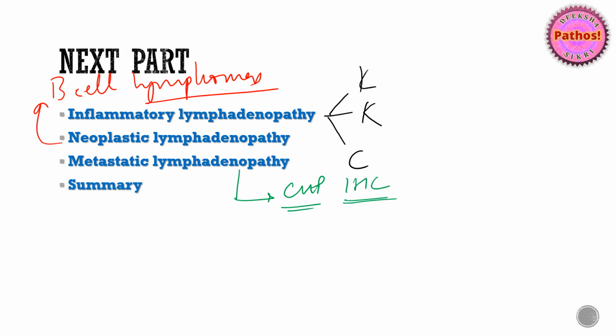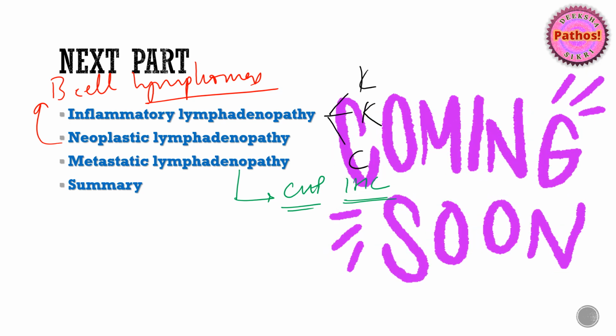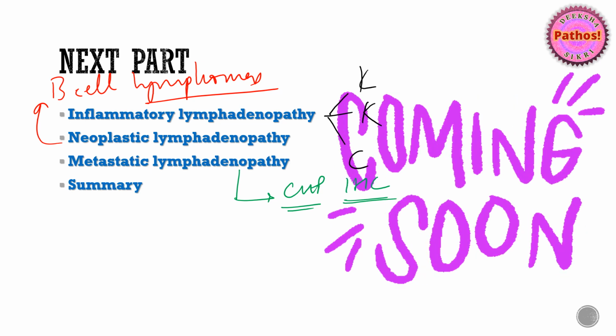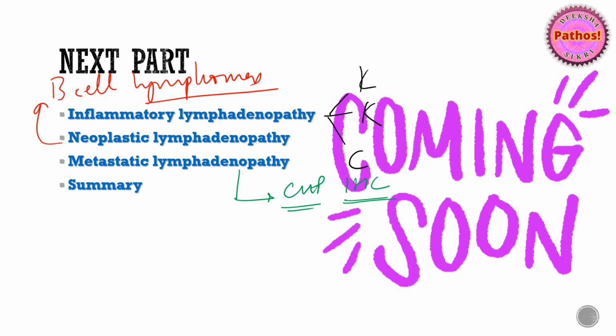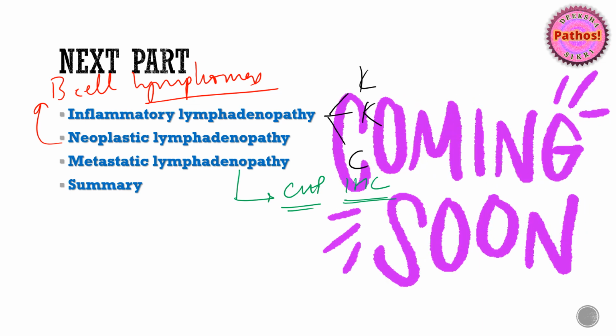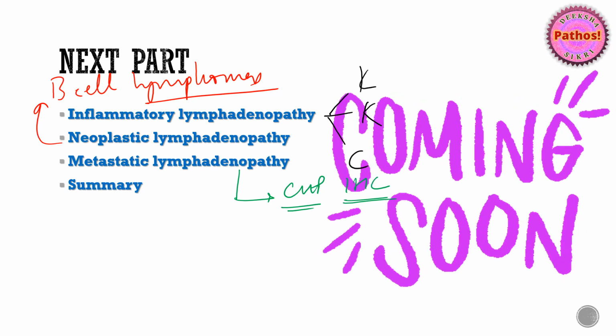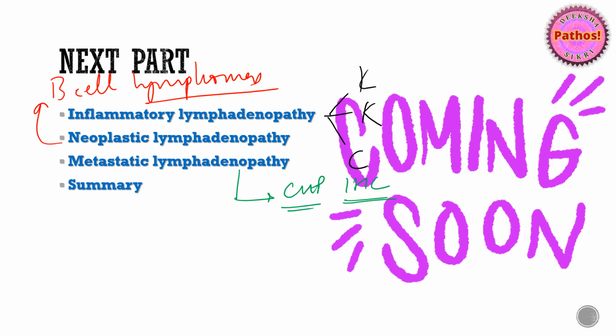I will summarize everything. So just to recap, the structure of the lymph node in this video, the reactive patterns, and a couple of infections. So you can pause anywhere you want, you can go through the slides, you can take down the tables. I wanted to stress a little on the images as well so you can identify.